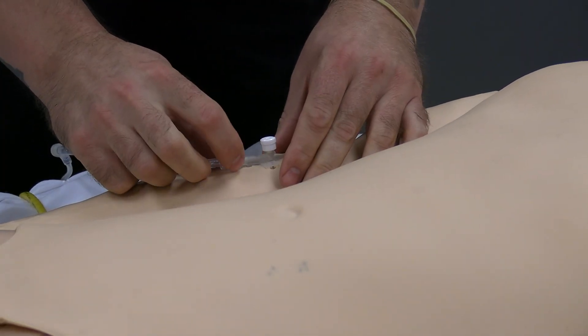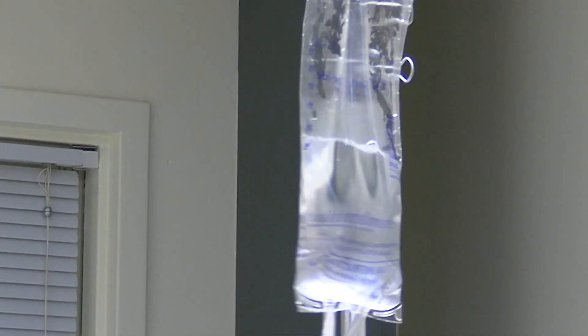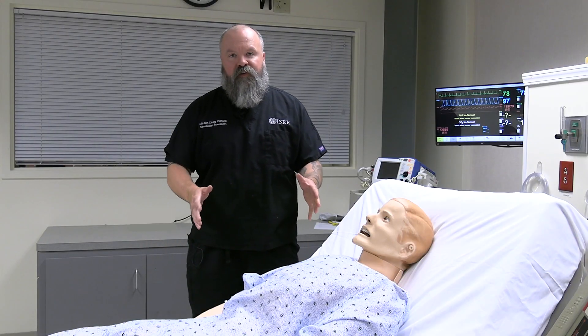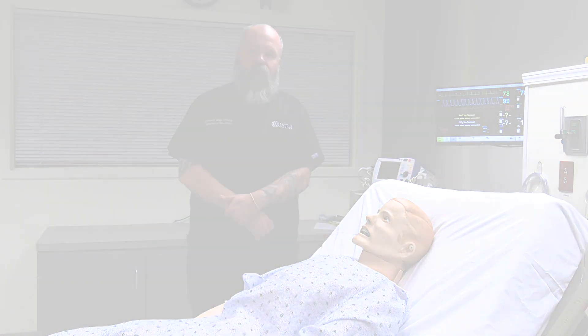Placing a real blood pressure cuff on the mannequin, it can be calibrated to provide an accurate blood pressure. SimMan 3G has venous access on his right arm so you can give IVs, meds, or any other fluid. Thanks for checking out this video and we hope you find it useful the next time you come to use SimMan 3G here at Wiser.